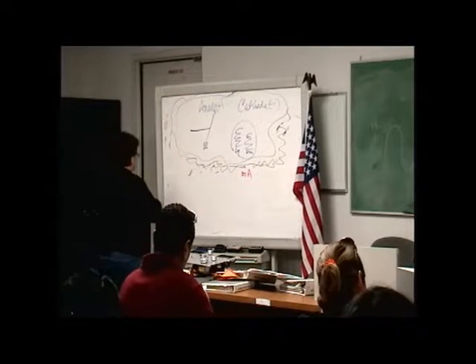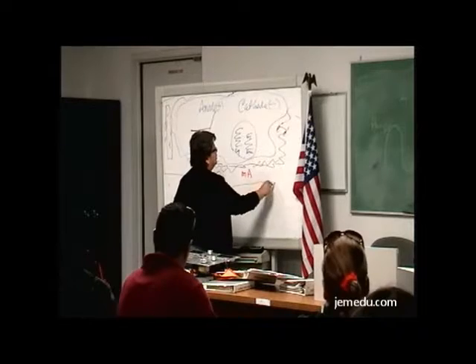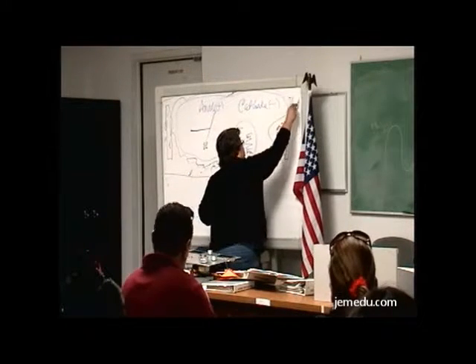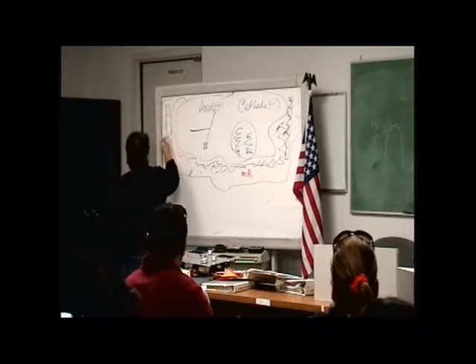And it's going to have something else on it on the side, all the way around it, and then we have these two things on the side. I have one on the cathode and I have one on the anode side.